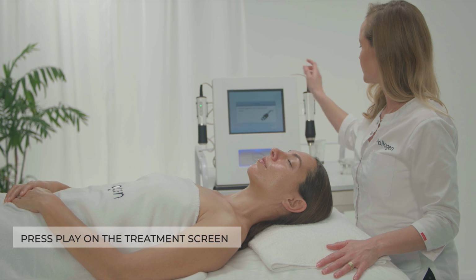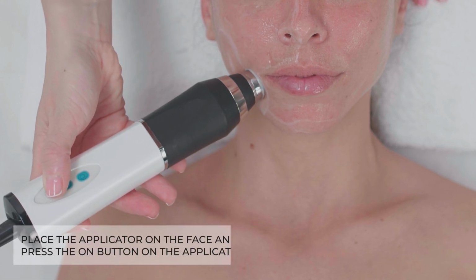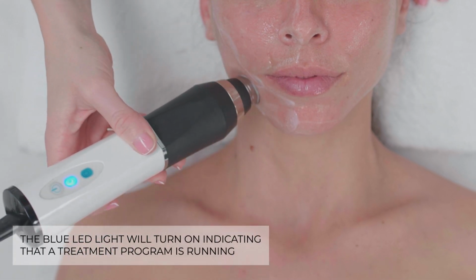Press play on the treatment screen. A green light will blink on the applicator. Place the applicator on the face and press the on button on the applicator. The blue light will turn on, indicating that a treatment program is running.